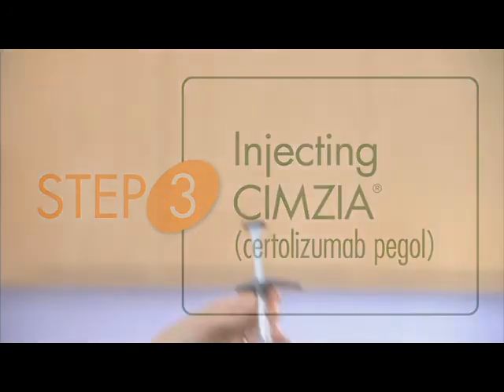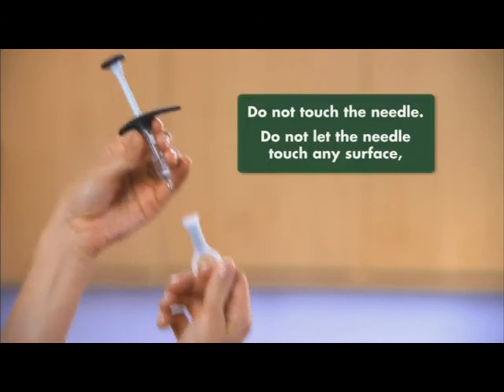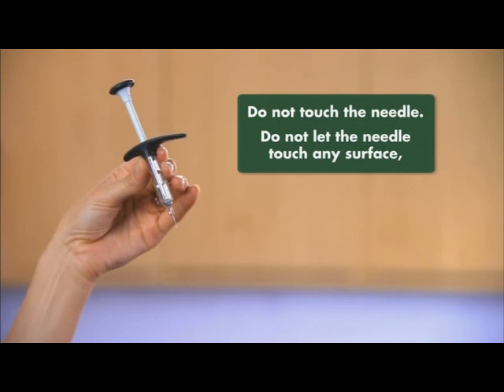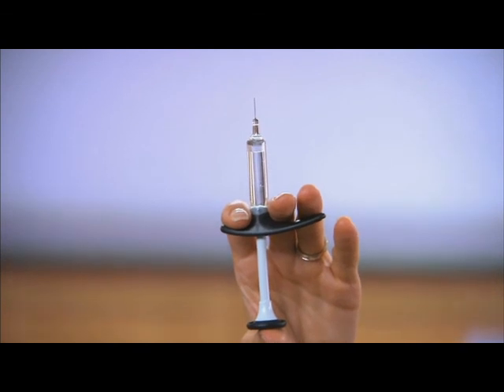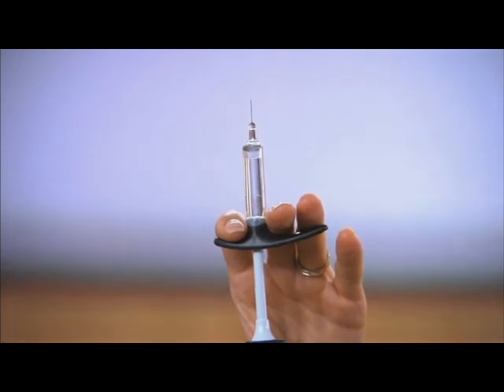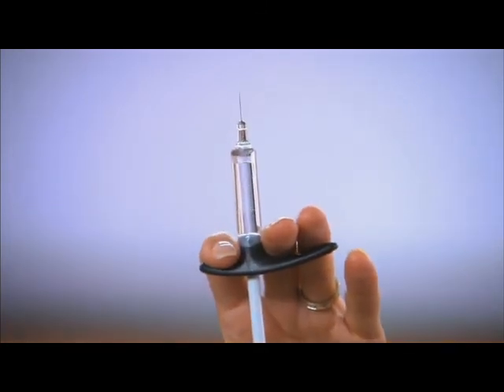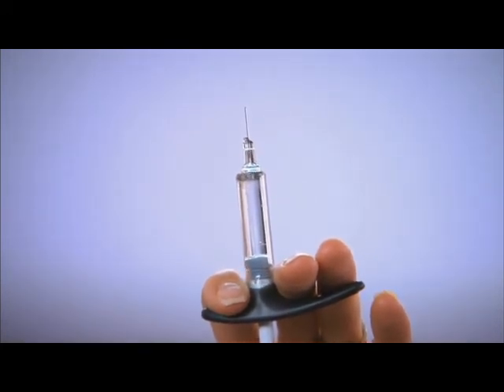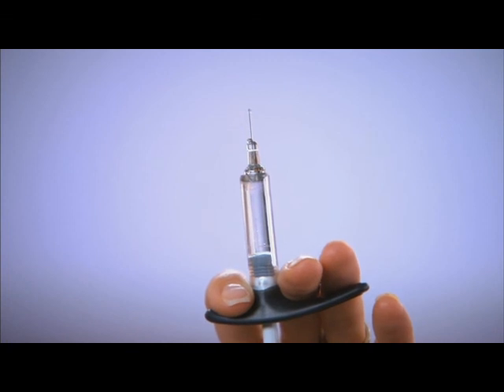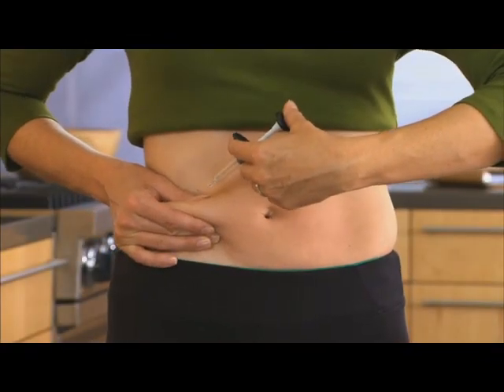Do not shake the syringe. Now you are ready to inject. Remove the cap from the needle, being careful not to touch the needle or let it touch any surface. Hold the syringe with the needle pointing up and tap the syringe until you expel any air, just like this. Stop when a small drop appears at the tip of the needle. Gently grasp the cleaned area of skin with one hand and hold firmly. With the other hand, hold the syringe at a 45-degree angle to the skin, like this.